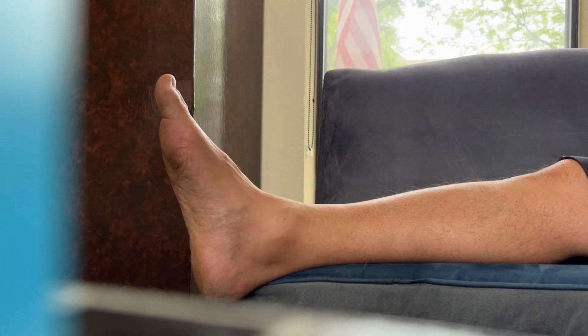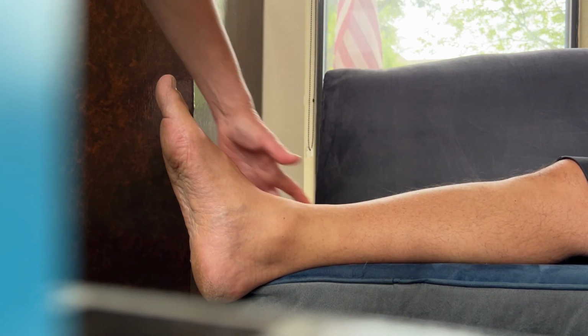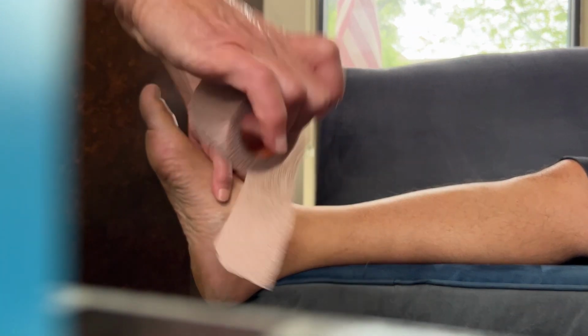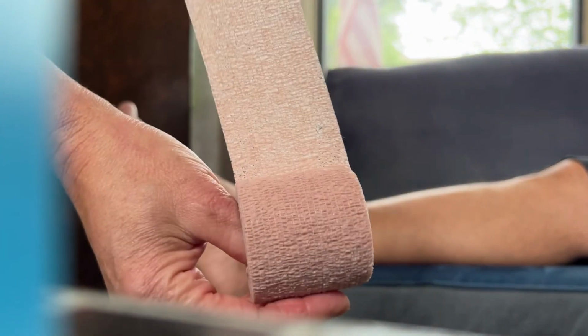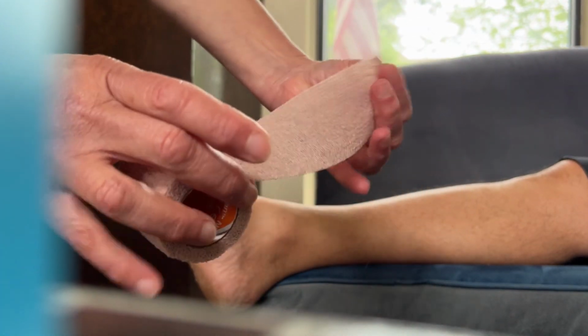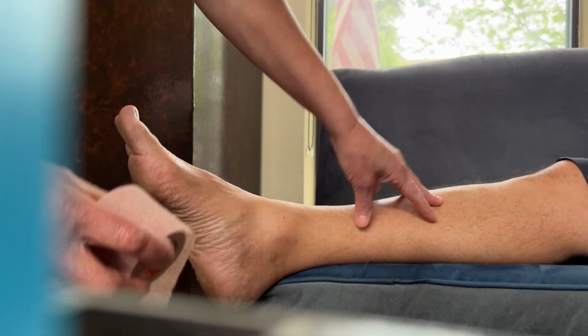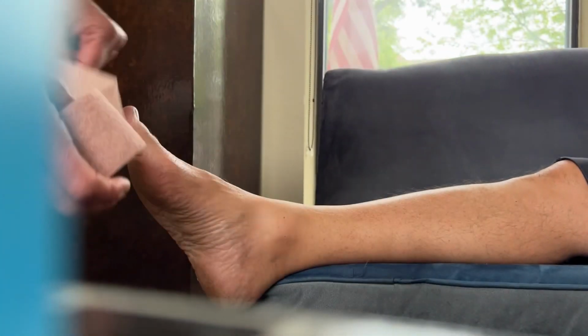I am making this video for a friend who just tore his gastroc muscle, and I'm showing him how to do an ACE wrap, but this is Coban. I like Coban better. You can get this at the pharmacy. You can get a tighter compression with it. Preferably for someone this size, I would prefer to go 2 inches. I think this is 1.5, but you'll get the idea.